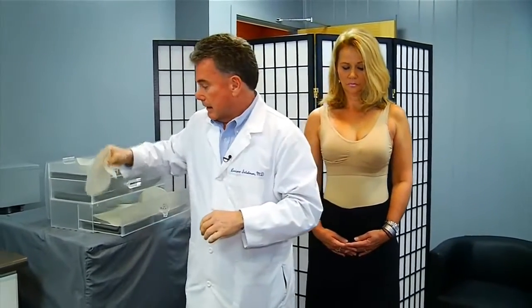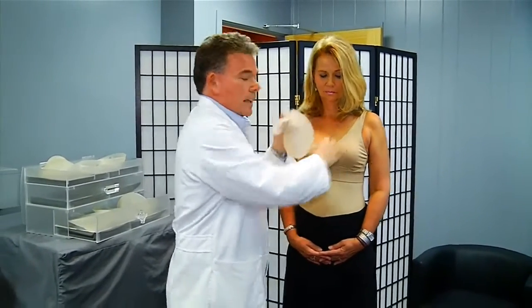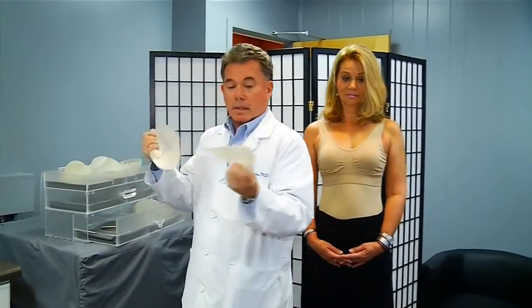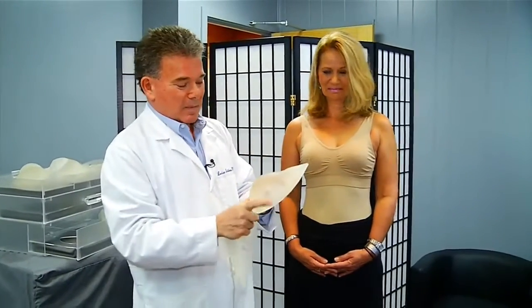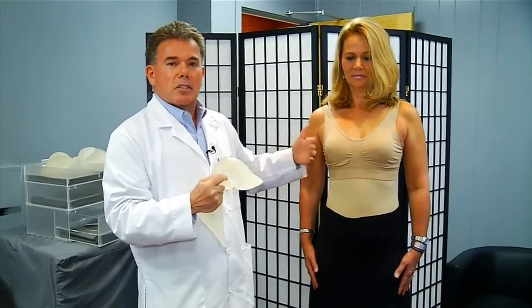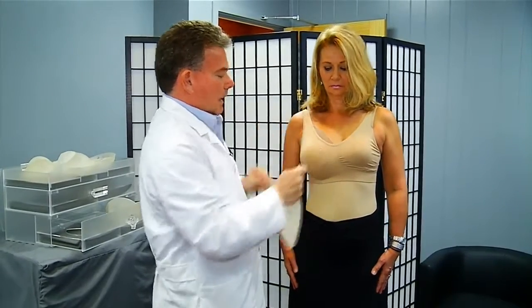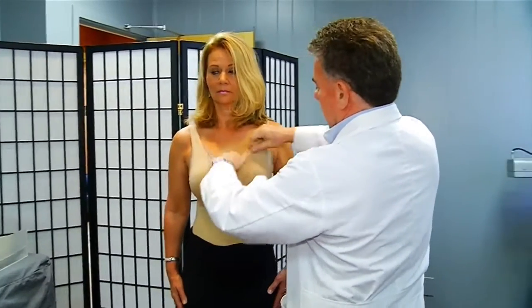Once I remove the sizers — I'm going to put it here just to illustrate — and remove the other sizers as well. Let's say you want to go really big. So you have these ones — these are 650. That's really big. For her, it's too big because the width of the implant doesn't fit her width. So there are many things to consider when doing an implant. You don't want the implant sticking out of your chest. So here we are — 650 would look like this for her, and this will look like this as well.